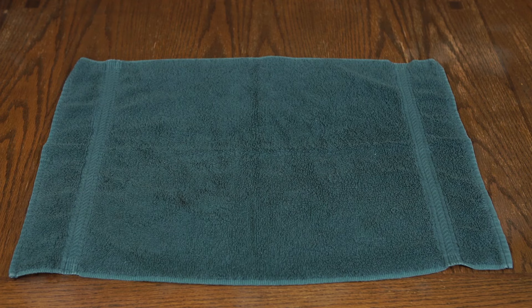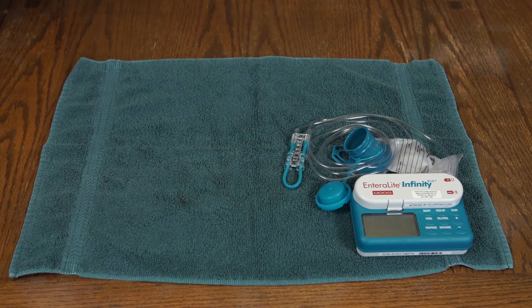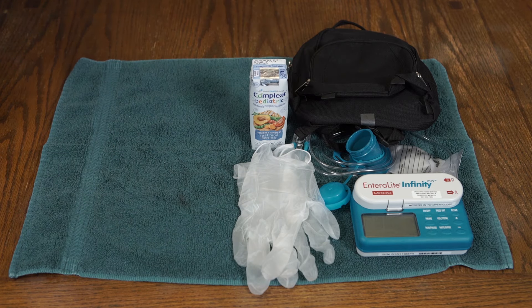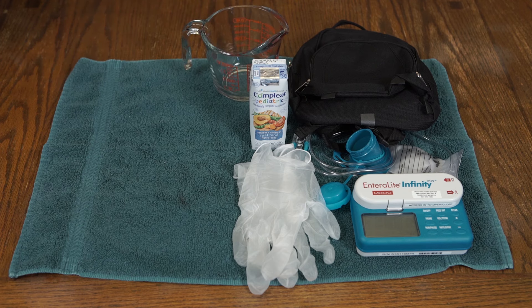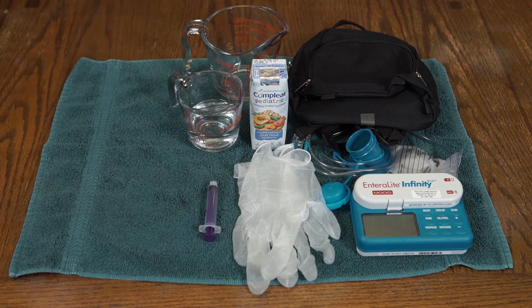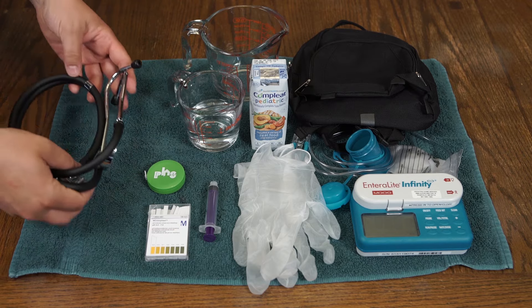Assemble the supplies you need for the enteral feeding: an enteral food pump, a feeding bag specific to the pump you're using, an IV pole or backpack, non-sterile gloves, formula, a clean container such as a measuring cup for the formula, another clean container with the type of water recommended for flushing the tube, and a small syringe. For feedings through a nasal or oral feeding tube, you also need pH strips, measuring tape, and a stethoscope.